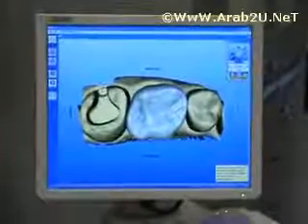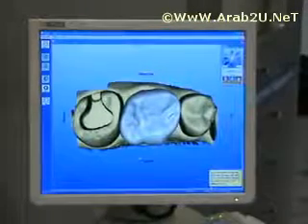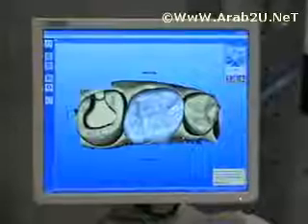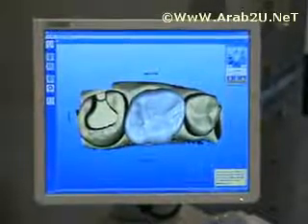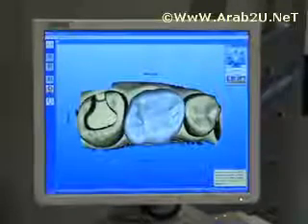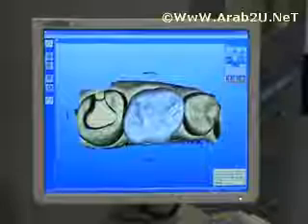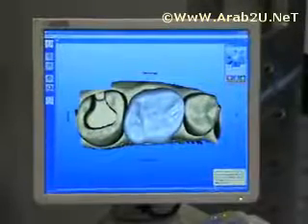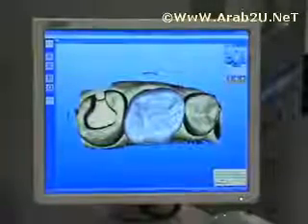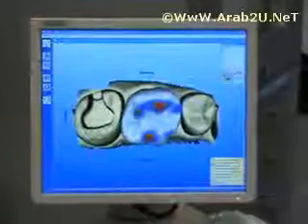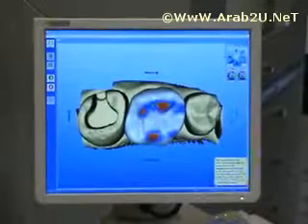Now, if possible, by slightly turning the crown in a few different directions, we can get a much better proposal. With the new software, there is not a tool available in this screen right here. However, by clicking the red arrow button and going one step back, it will now activate the position and rotate tool. Up in the right-hand corner, you can now see that position and rotate are now active.